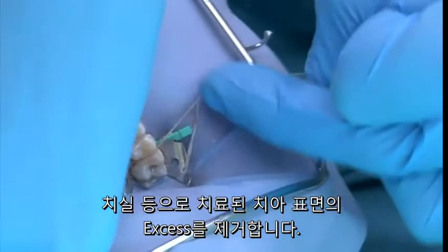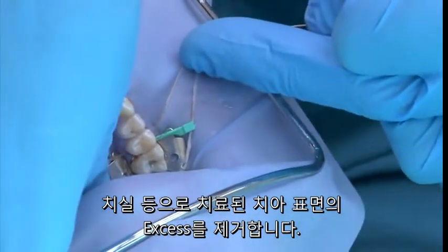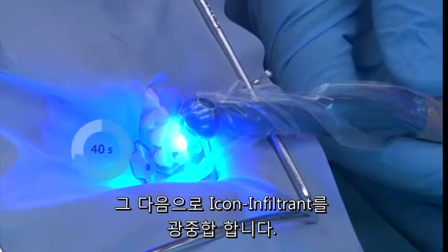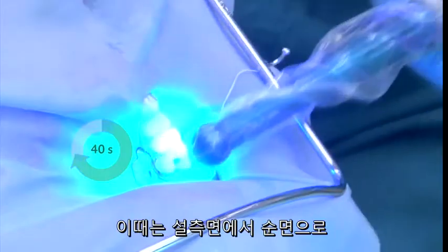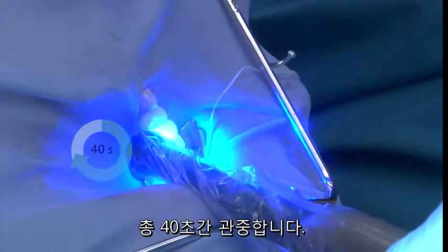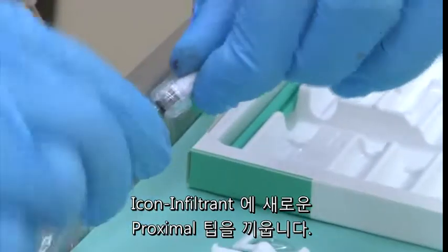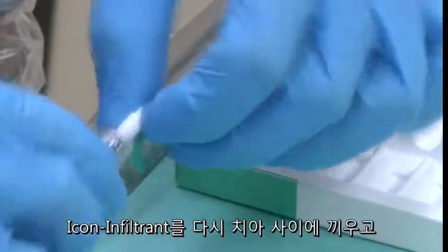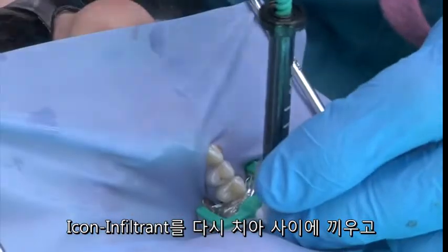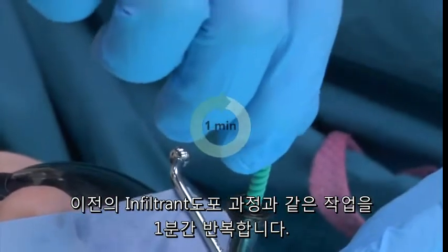After three minutes, remove the applicator and run dental floss or dental tape through the treatment site to remove excess material. The material is then light cured from the buccal, from the occlusal, and from the lingual for a total of 40 seconds. A fresh proximal tip is then attached and a second application of the Icon resin is placed onto the proximal surface for a one-minute period, following the same steps as previously taken.